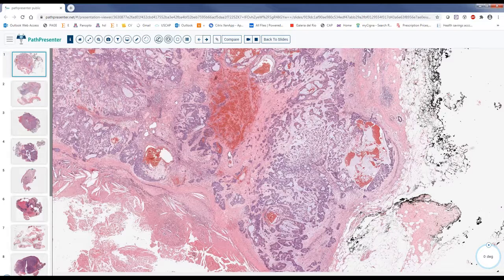You don't take it like, if somebody is convinced it is cancer, and somebody else is not convinced. No, everybody will say, yes, this is a real cancer. There are huge changes, there are metastases, there's a lot of necrosis. This is a cancer, and we see in the background pleomorphic adenoma. Okay, so these are basically the important clinical parts that you have to address. You give the size of the tumor, you give the margins, and you give the diagnosis.